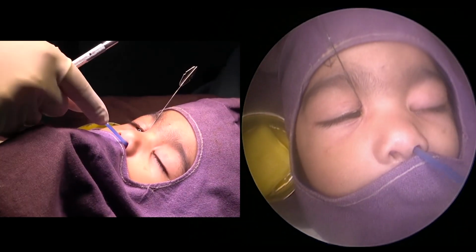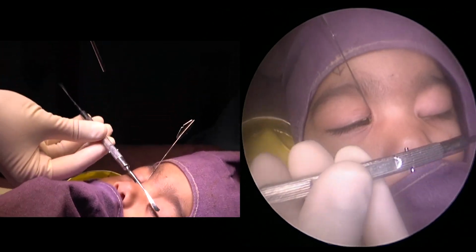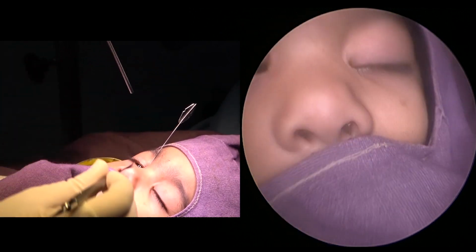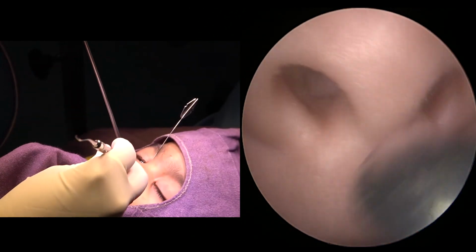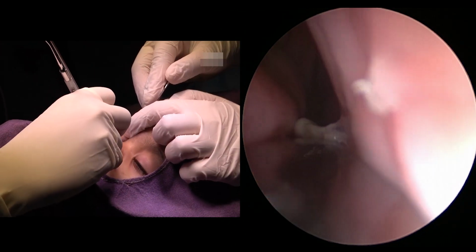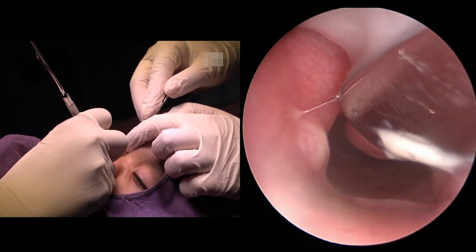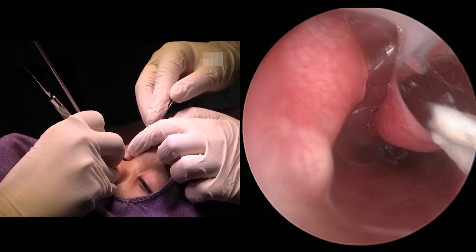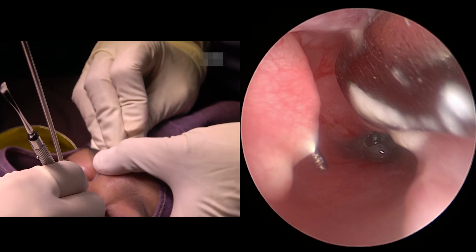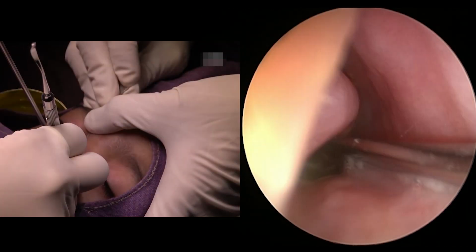The cotton buds are removed from the nasal cavity. A 2.7 mm 0-degree endoscope is used to visualize the nasal cavity. The inferior turbinate is medialized using the blunt edge of the periosteal elevator, and a direct view of the inferior meatus is obtained. Probe is then advanced and the obstruction is overcome under direct visualization.